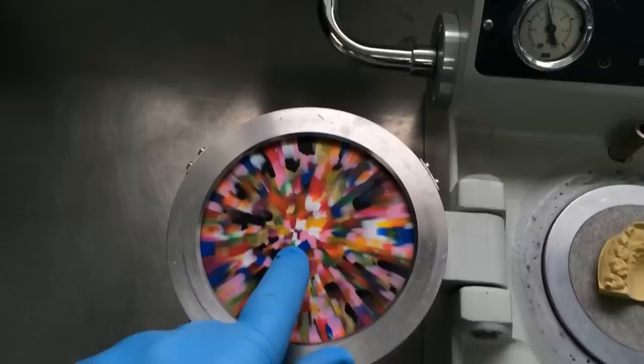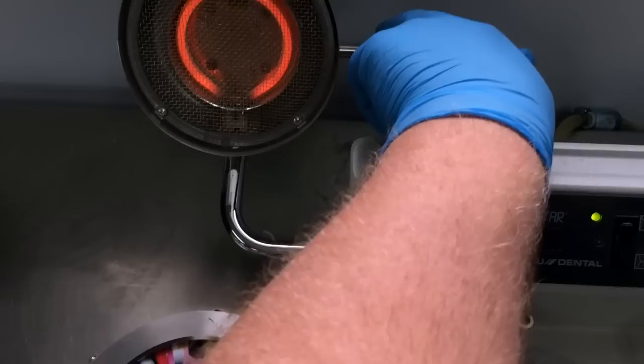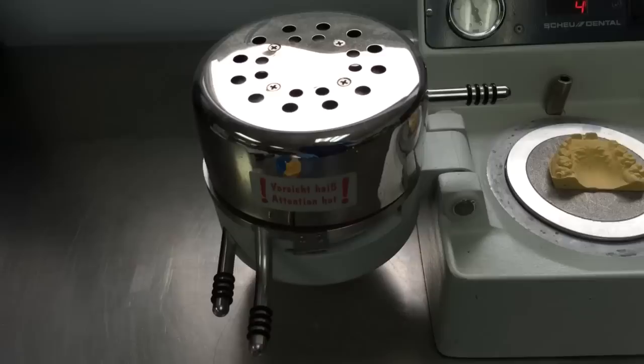Now up here what there is, is there's this big heater. So what we're going to do is we're going to flip that over right now and that is going to start to heat up the mouth guard blank. It's going to start to basically melt it.